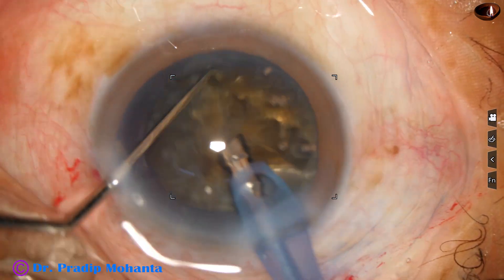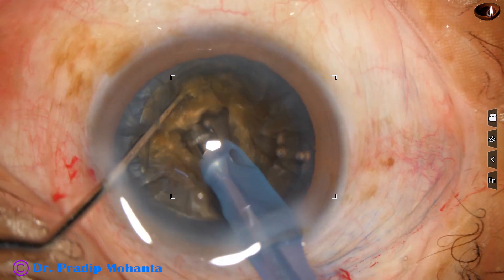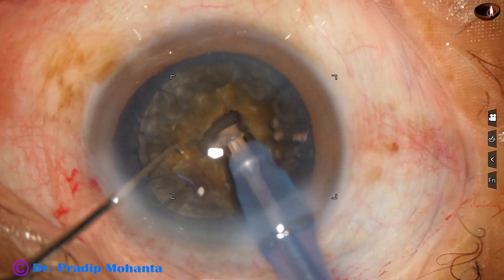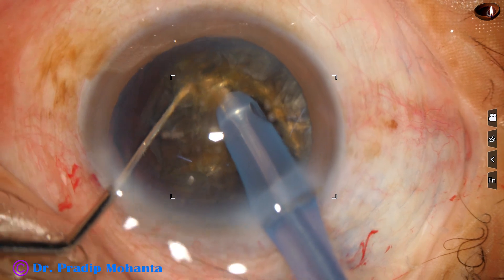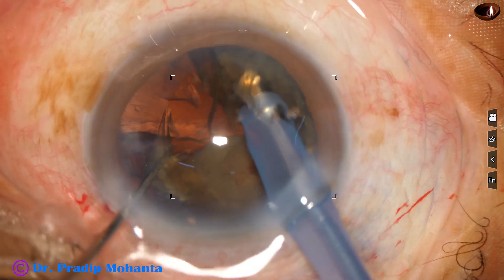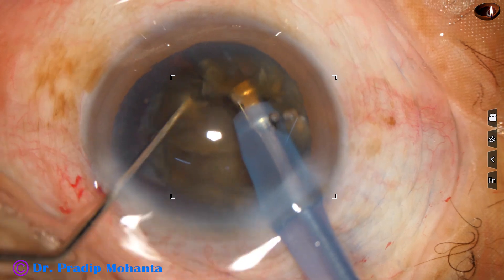My next attempt: vacuum is only 80 mmHg, flow rate is 20, and ultrasonic energy is 80%. I make a deep crater at the center of the nucleus. I wanted to do submarine chop, but now my strategy is to do crater and chop. A crater has been made, and now I am chopping the nucleus into several pieces — from the deep crater I go into the substance of the nucleus, hold it, and use the chopper to crack it.